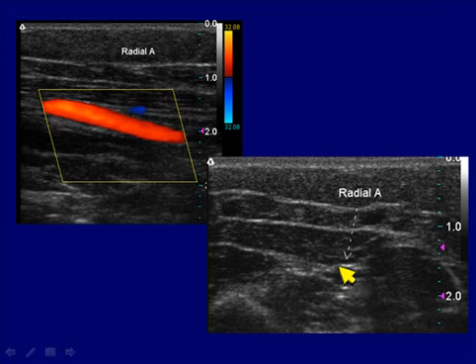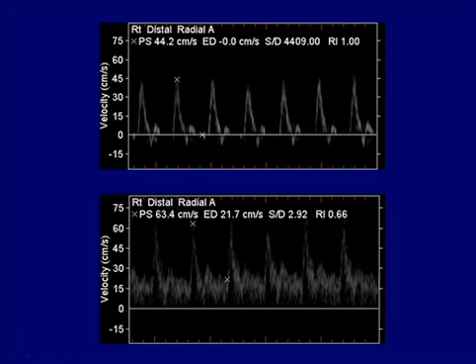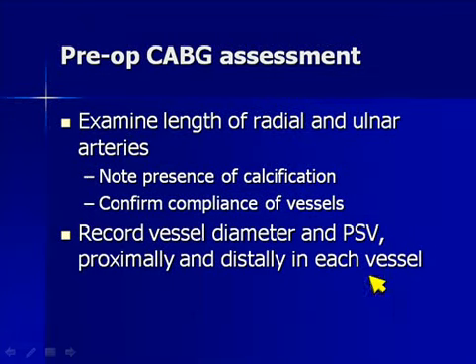Look around. The radial artery has to have its veins next door, and that's going to be your landmark to distinguish this from this, and don't get confused. Again, the radial artery, multiphasic, high resistance pattern, except if your patient is hot or they're vasodilated. Some drugs can cause this as well, and we can see this vasodilatation. However, it is still normal.